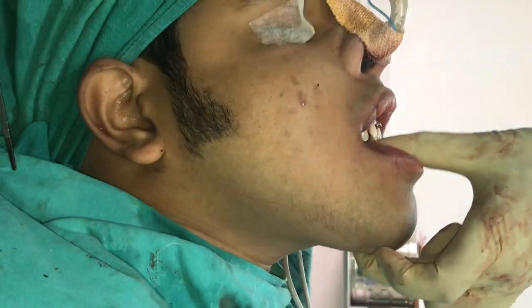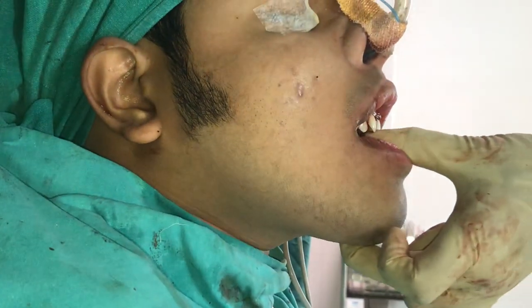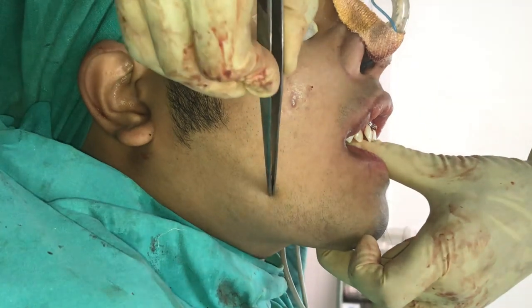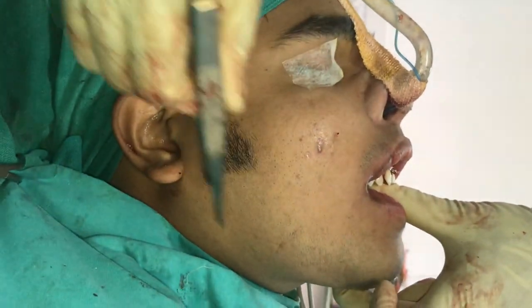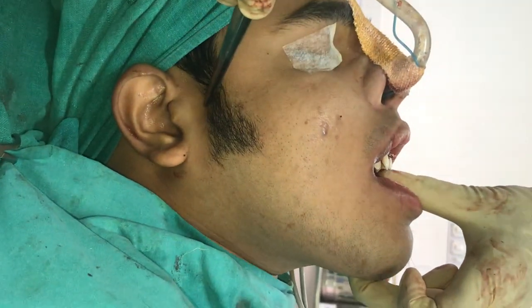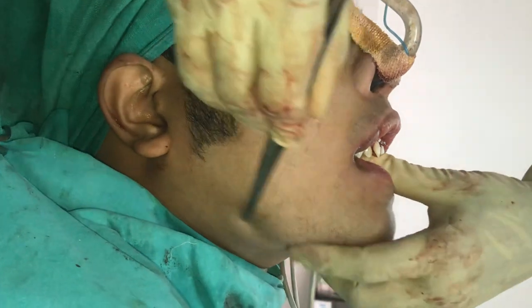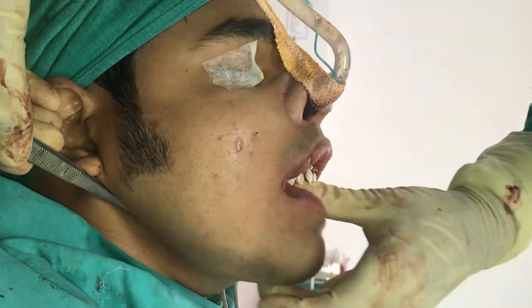This is how he was. We're going to take it back and you can see how the angulation changes. The split is extending all along — it's a long split. This is his original profile, and now we're going to take it back and give it the more correct angle that he wants.